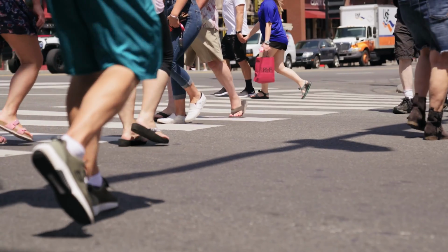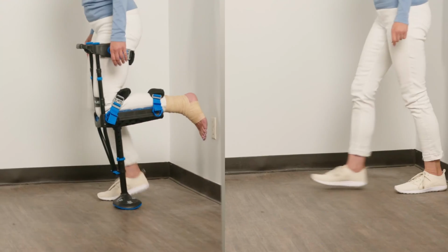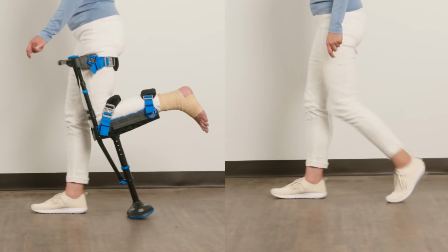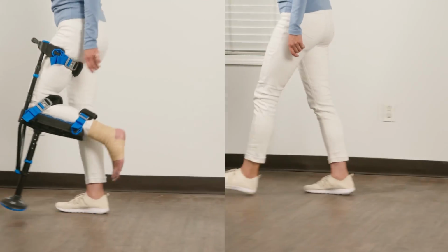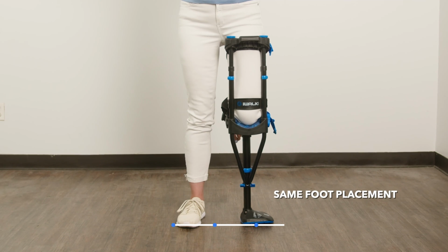Fitting. People don't think about how to walk. They simply do it by recruiting the muscle memory they have developed over their lifetime. The iWALK becomes your patient's lower leg. So the closer you come to mimicking their normal leg geometry, the more they can recruit their existing muscle memory for walking. The height must be the same. The foot placement must be the same.